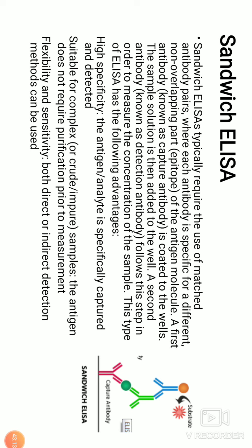Disadvantage, again, you have non-adherent cells on the cover slip with chemical bonds. Cross-reactivity might occur with the secondary antibody, resulting in non-specific signal, but that is relatively very, very less. An extra incubation step is there in the procedure, but that is advantageous. Coming to the next, it is sandwich ELISA.